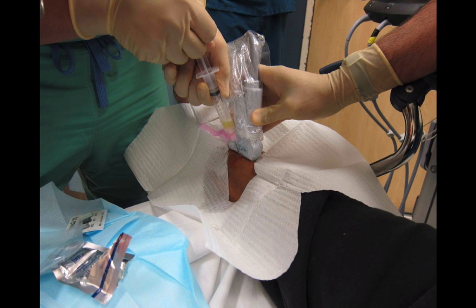And this is one of my residents coming in. I'm holding it for him because he's a little bit more novice, and he comes right in, very steep angle, and aspirates and pulls out fluid.